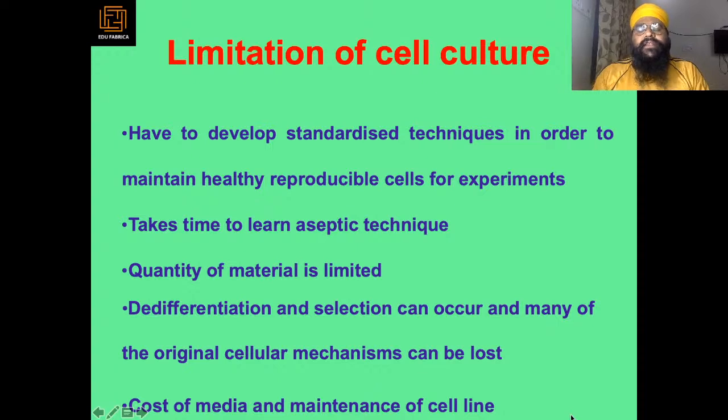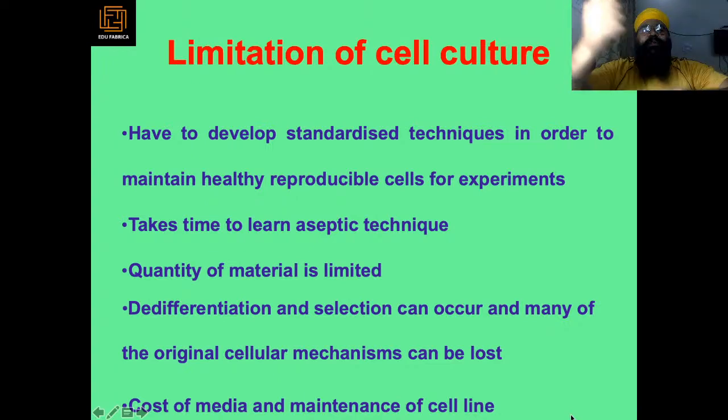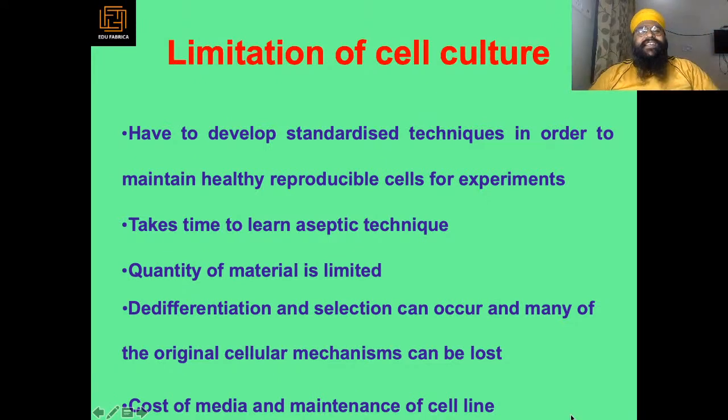Your hands move automatically: splitting cells, changing media, adding trypsin, making a new cell culture, like a robot.